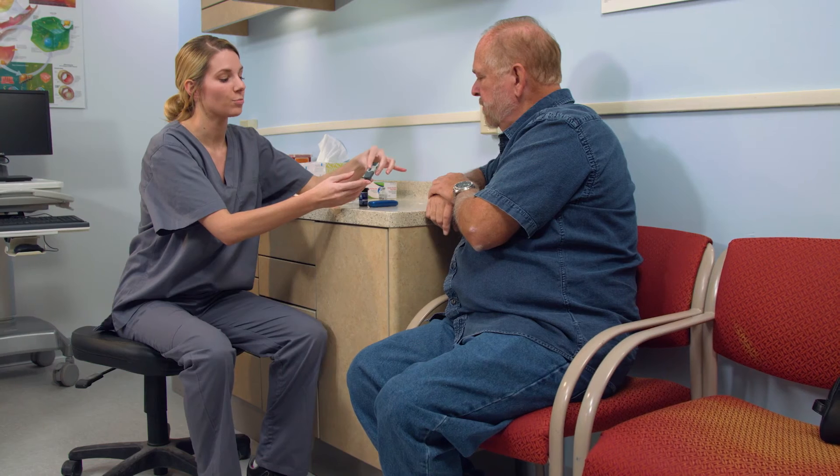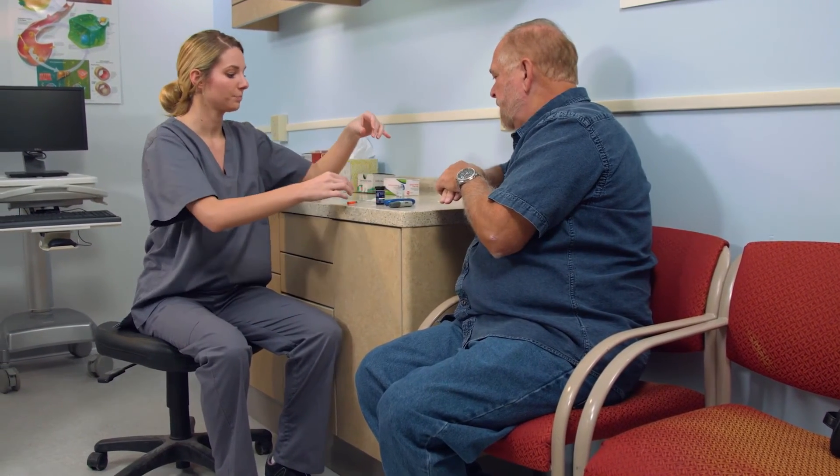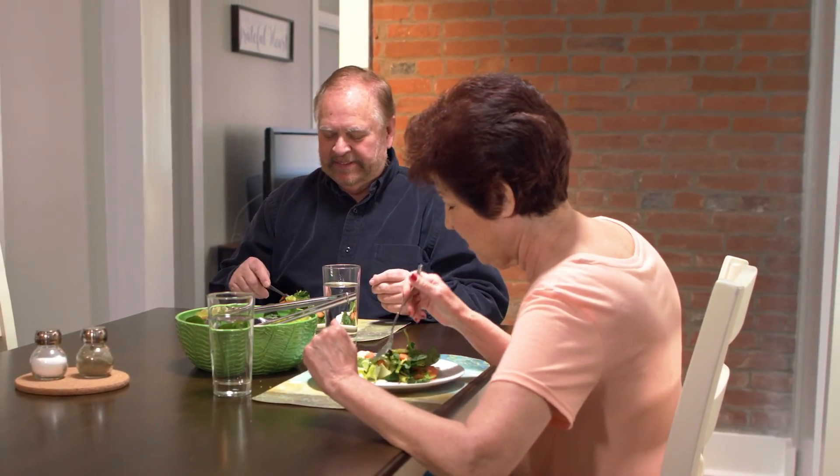Giving yourself an insulin shot at the right times of the day, in accordance with your doctor, will ensure a normal blood sugar level. This procedure will quickly become routine. Controlling the effects of diabetes is vital to maintaining a healthy lifestyle and avoiding what can be serious complications from the disease.